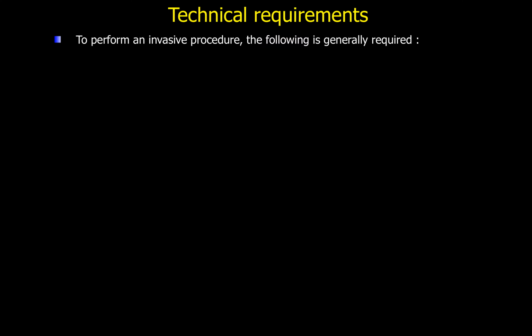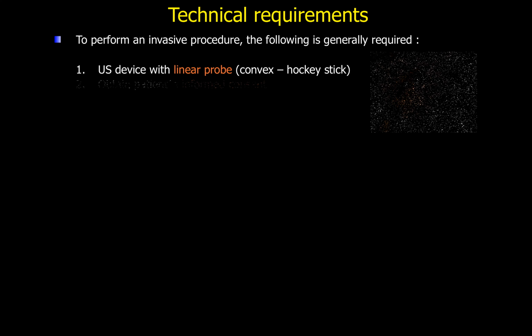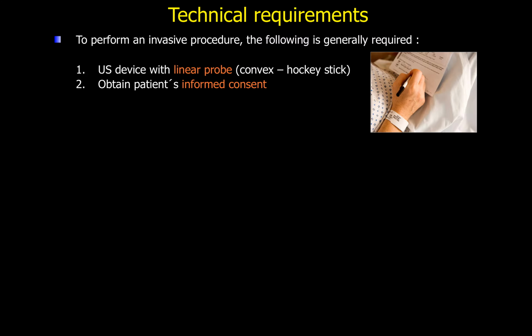To perform an invasive procedure, the following is generally required. We need ultrasound with a linear probe. We always have to obtain an informed consent.